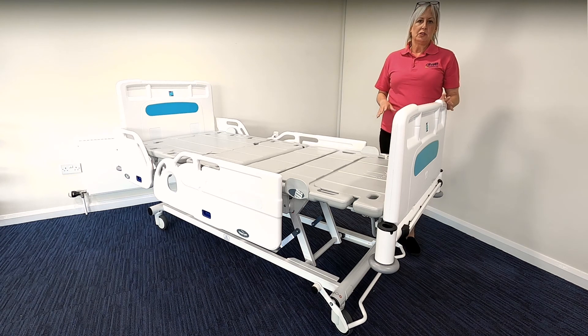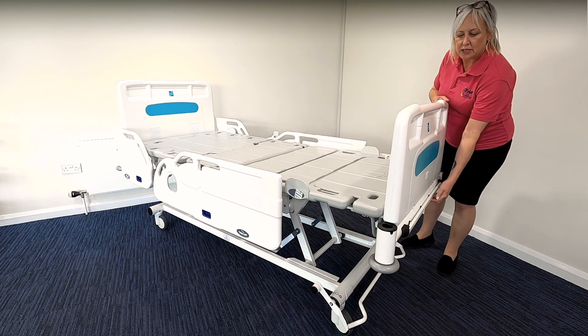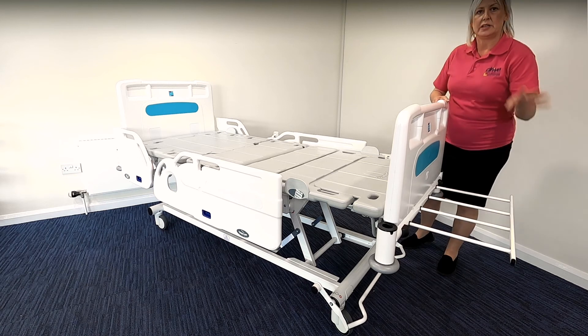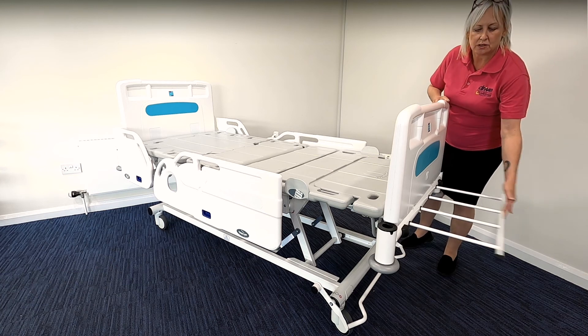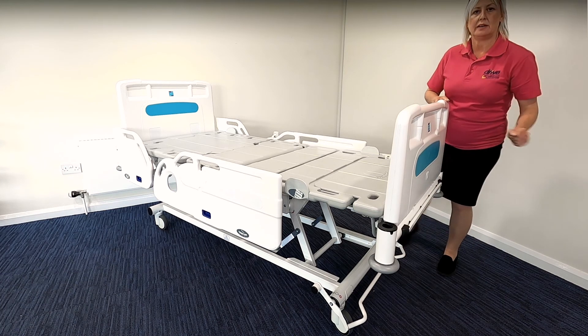The bed also has a handy linen tray which is found here — you can simply pull it out. It takes a maximum weight of 20 kilograms, and when it's no longer required you simply pop it back in.